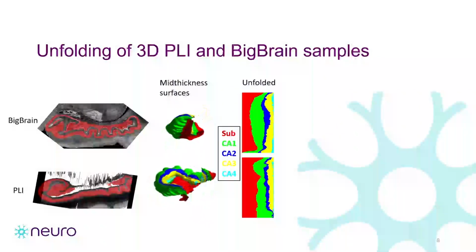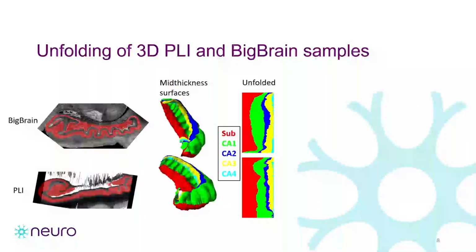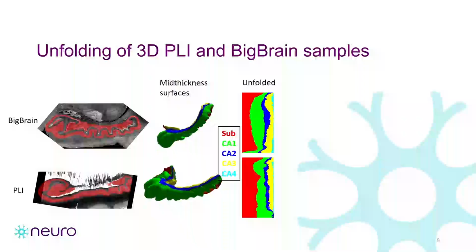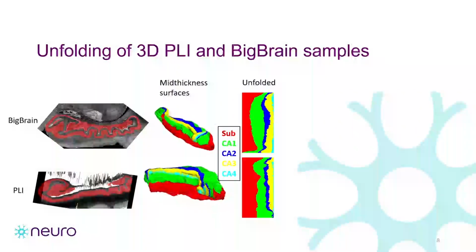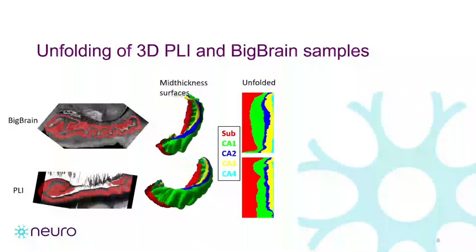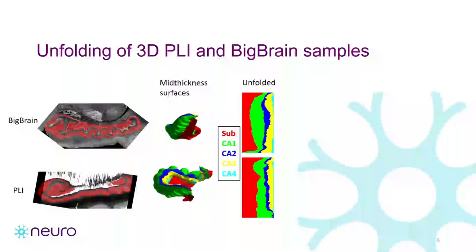So that lends some support to the idea that a 2D topology is a nice way to represent the hippocampus to minimize intersubject variability. As for your question about in vivo work, currently the way that HipUnfold is set up, it doesn't do any registration in unfolded space. I'd like to develop that next. Hopefully that would improve the overlap we see between subjects even further.